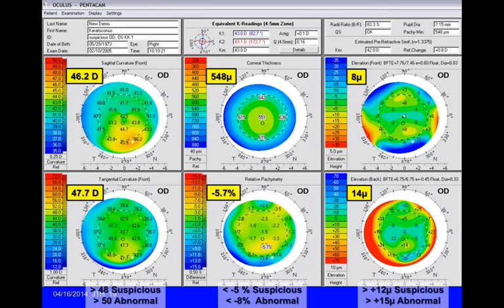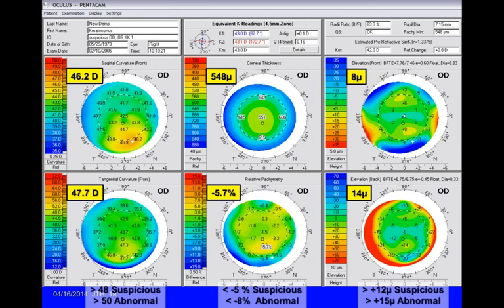There's a comment that the pointer can't be seen. The lower right-hand corner shows 14 microns. I can see the pointer now, so keep going. That 14 microns is suspicious, and this is the patient's right eye.